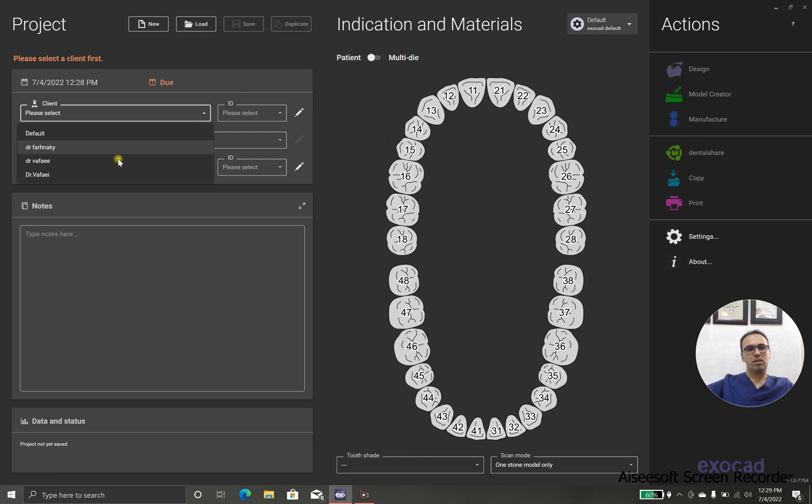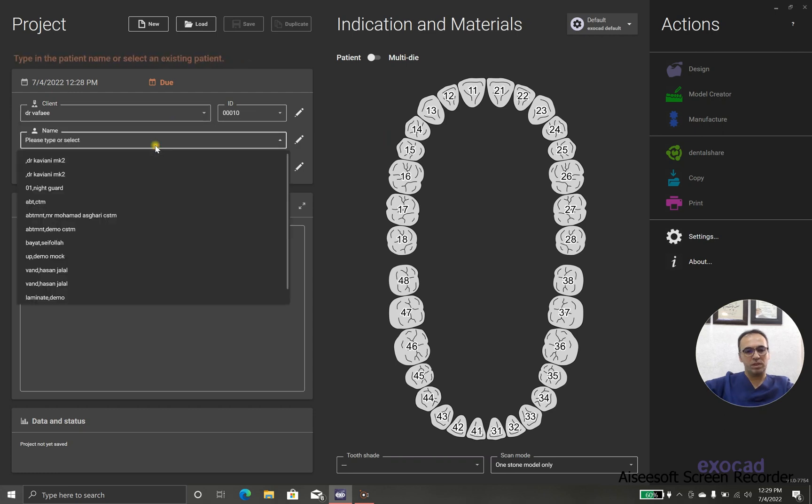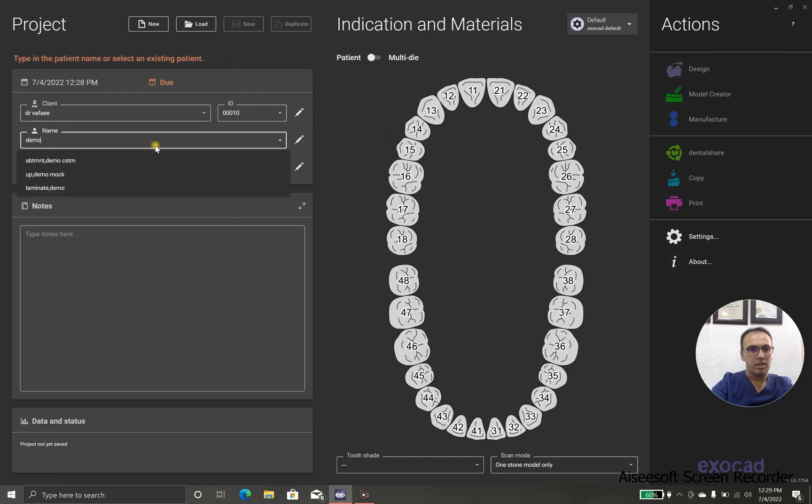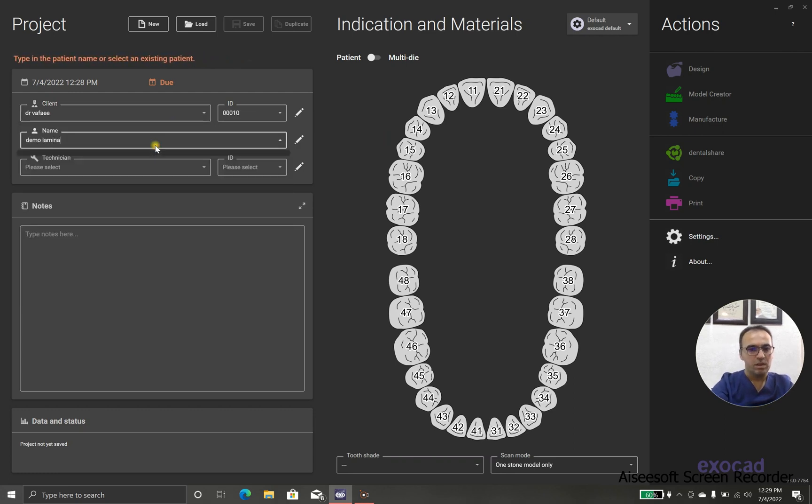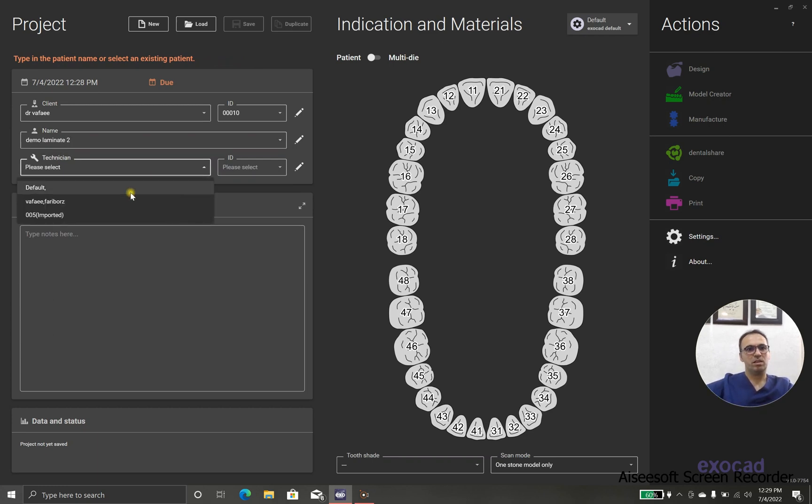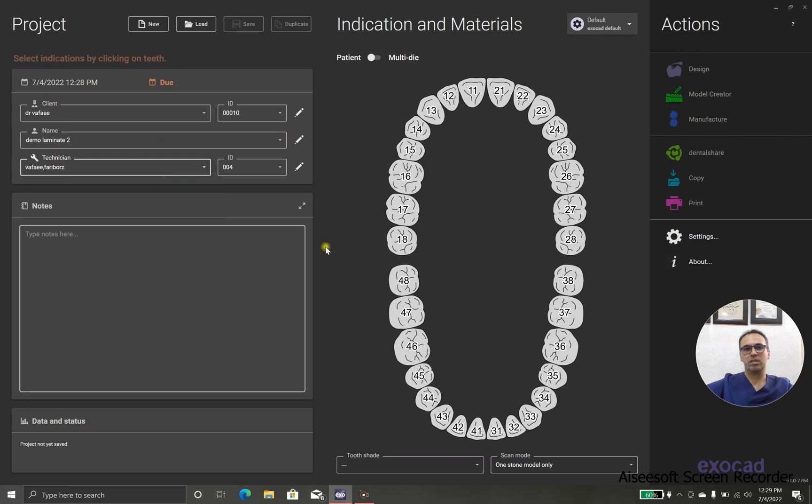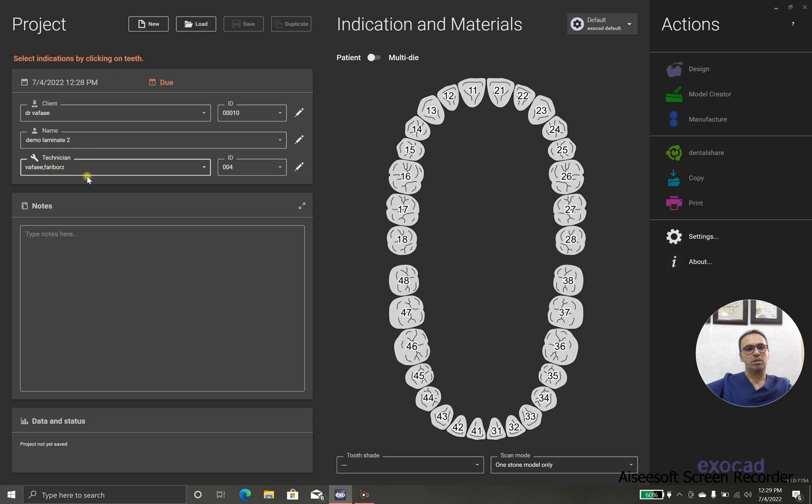First of all, as I told you before, we create a case, call it laminate level 2, because this is the second time I record this video, and after that, we choose the technician client.